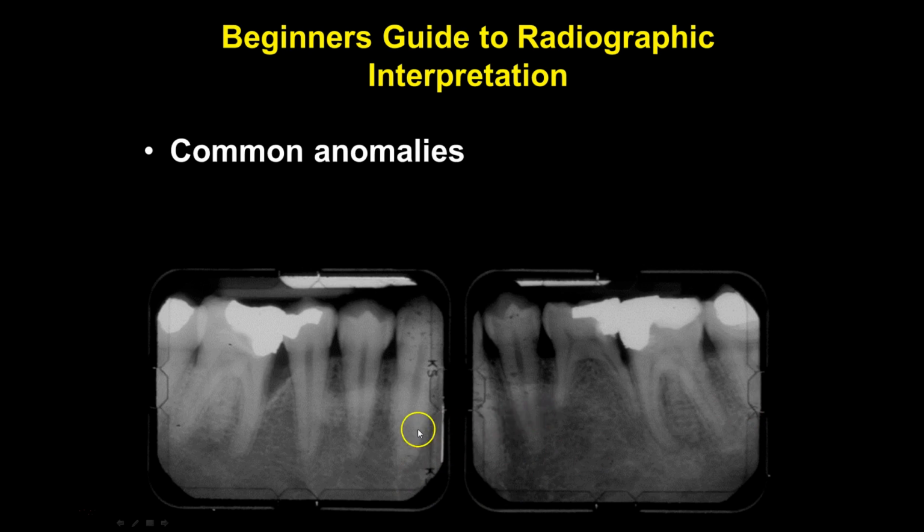There are some film processing errors on these because these are actually scanned images of film-based products.